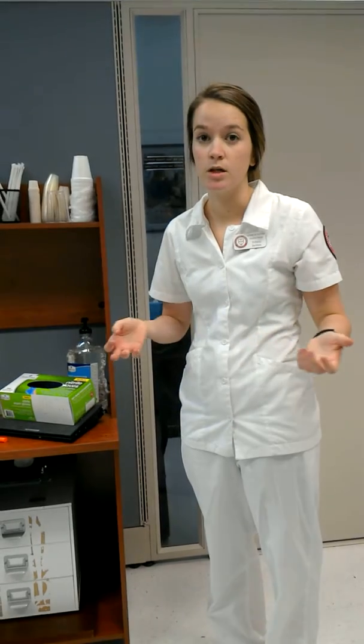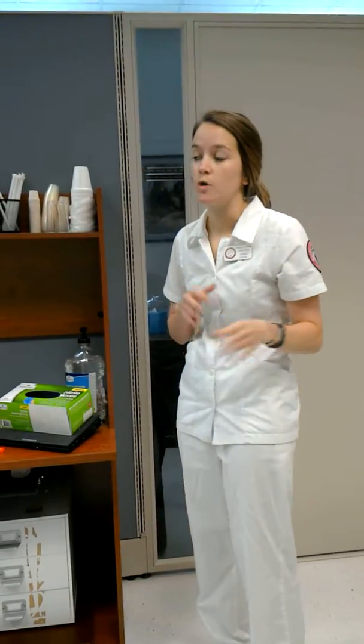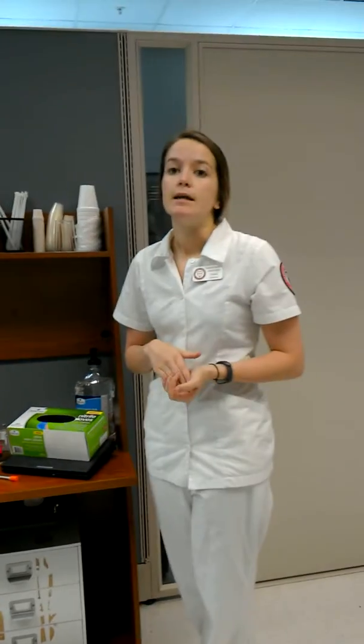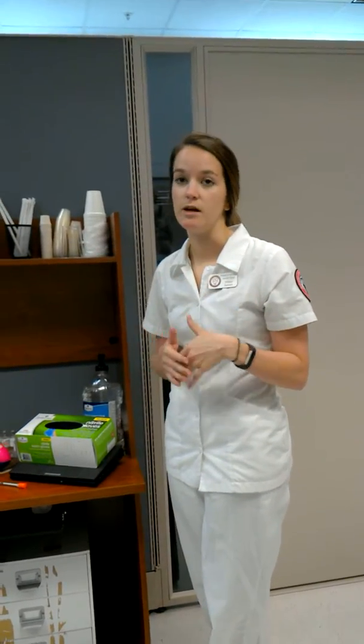and administering insulin. So before you can do that, you have to know your patient's blood glucose levels. So after I check my patient's blood glucose levels, I'm going to check the MAR and just make sure that I have an order for this type of insulin. And so I identified my patient whenever I checked the glucose. They had said the right name, right date of birth. And then I went ahead, their glucose was a little high, so I went ahead and did an assessment.